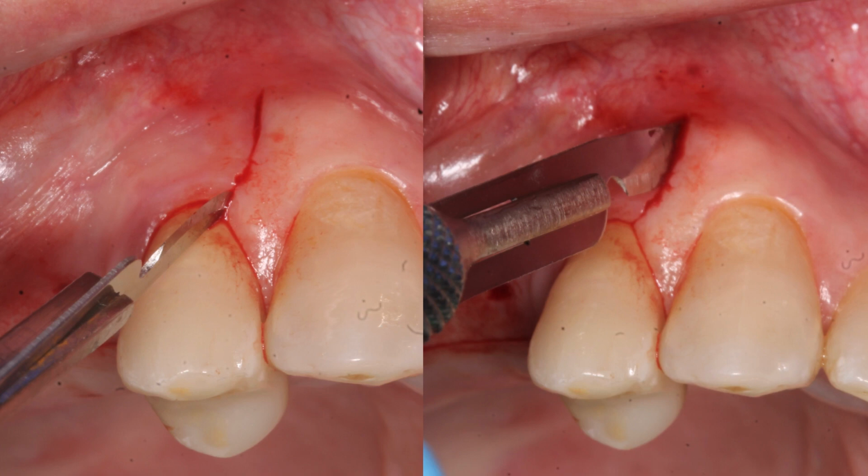I am particular about how soft tissue incisions should be precise, clean, and crisp. After having trained so many clinicians doing this type of exercise, I realized that many people pay not much attention to this, and as a result, we end up with a lot of soft tissue deformation, gingival recession, and a lot of not so clean healing can be evident from this very exercise.